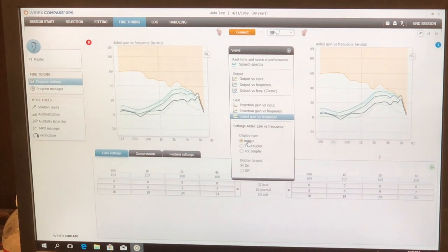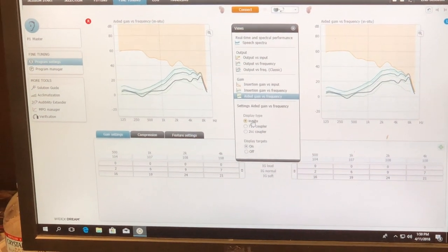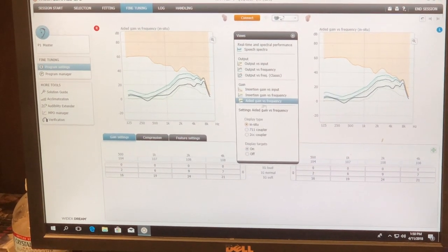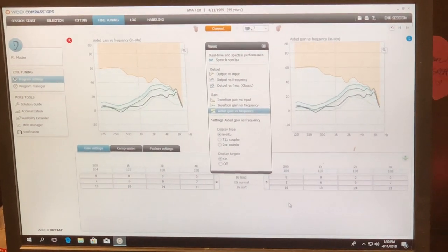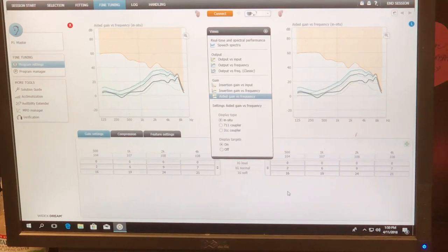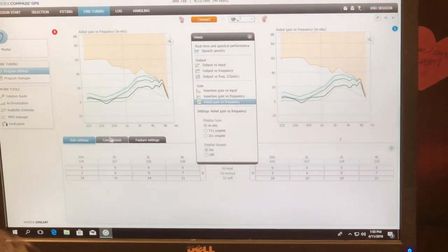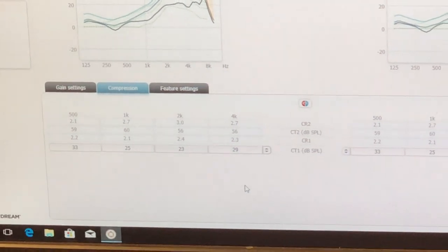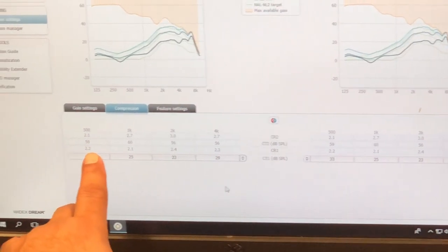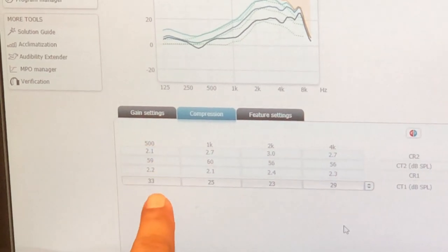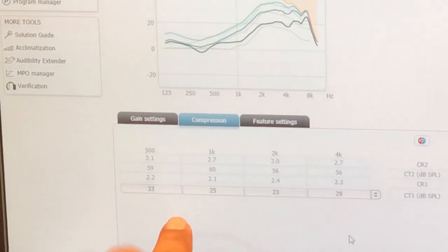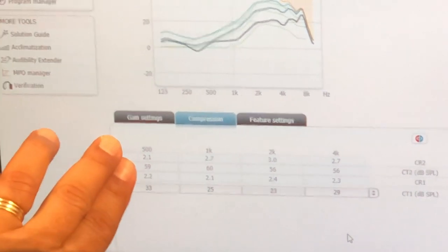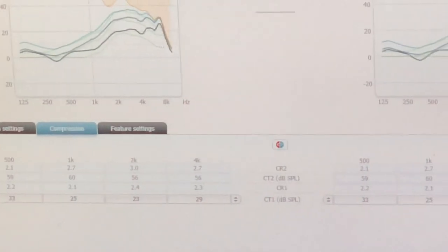So now I've got NAL-NL2 in. Notice you didn't do a whole lot of math because it's doing it for you. But you do have control over the compression. Here's my compression ratio one, compression ratio two, knee point one, knee point two. So these two guys go together and these two guys go together. So let's go back and look.